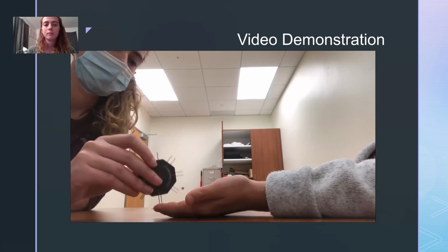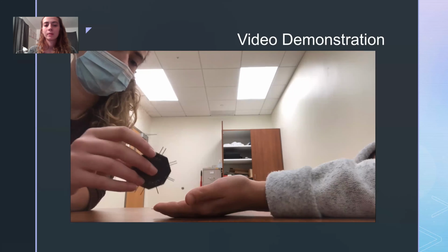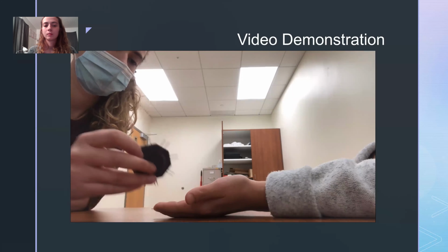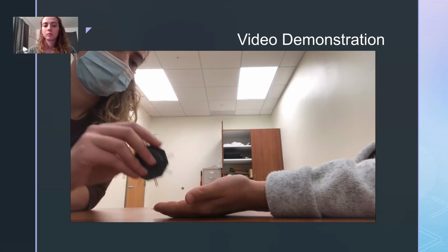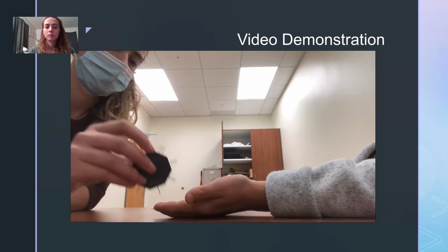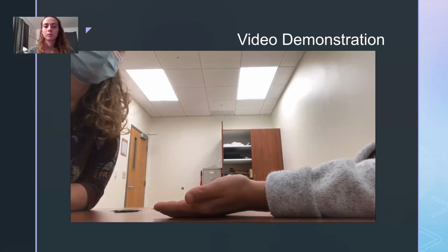Rather than doing 7 to 10 trials for each distance, once Alina has correctly answered the first 3 out of 3 correctly, it proves to me that she has good discrimination for that distance, so I move the distance down. This decreases the time needed for the test. 2, 1, 2. Perfect. Great job. That's the end of the test.